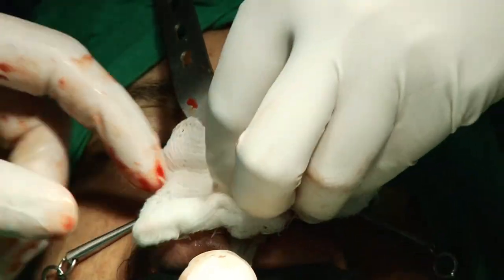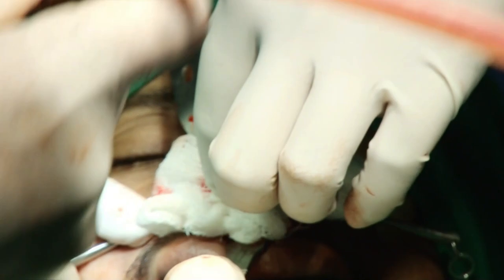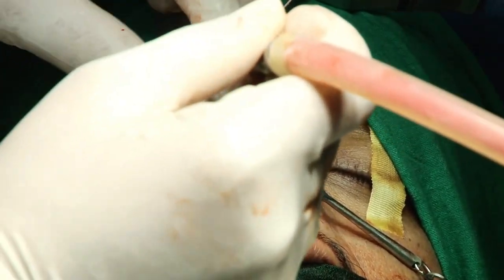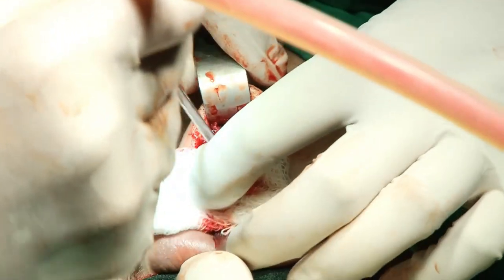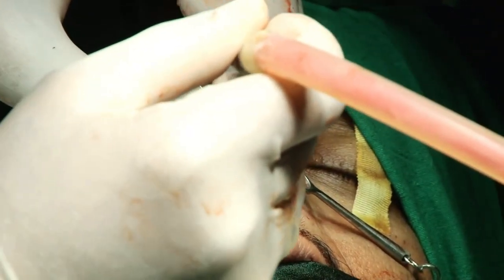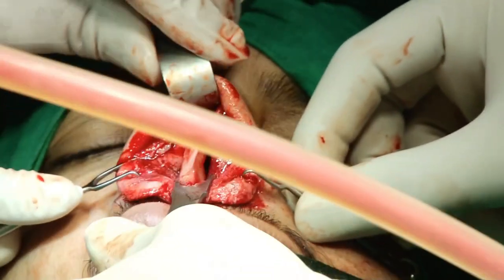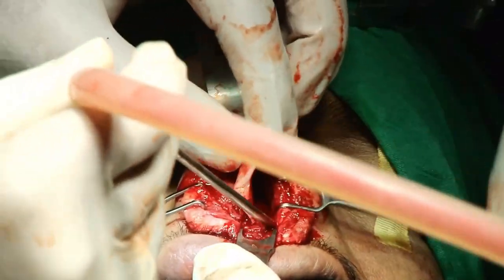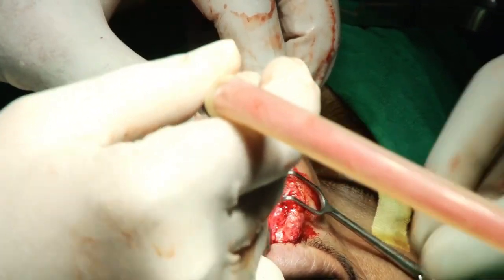So now the tension of the septum is released completely. So we excise the excess deviated part. We harvest the septal cartilage. This is our L-strut. This is the superior dorsal part. This is the caudal part of the septum.